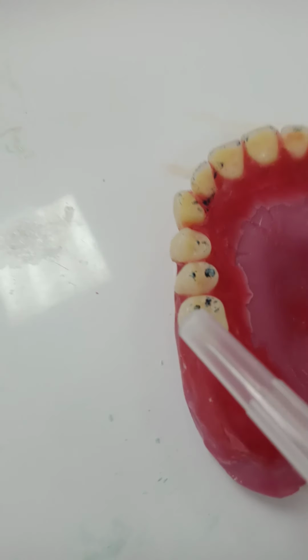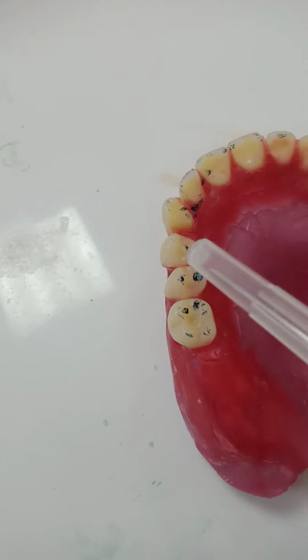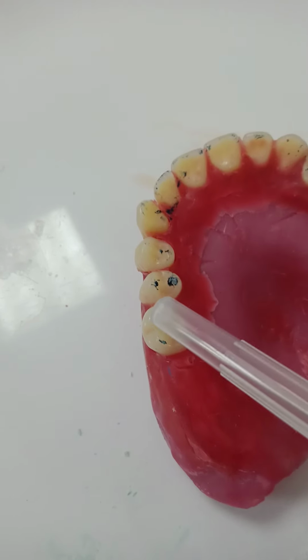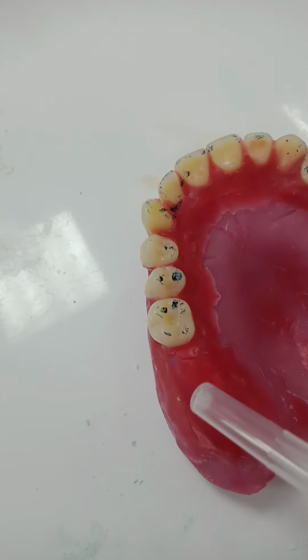The other side, also we have these two non-functional cusps working. I know that the technician followed the lower occlusion, but even when we follow the lower occlusion, we leave some freedom for lateral excursions. So once more, we're going to do the curve of Wilson on this tooth and this tooth.